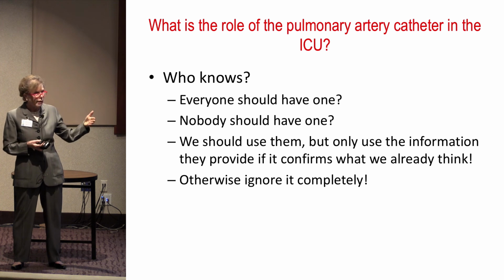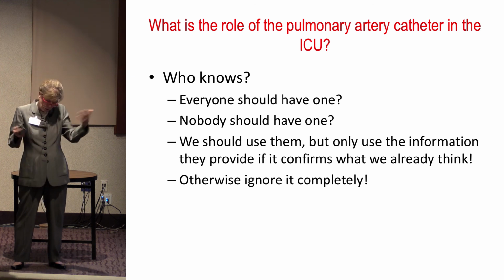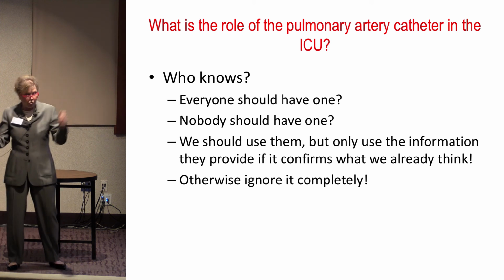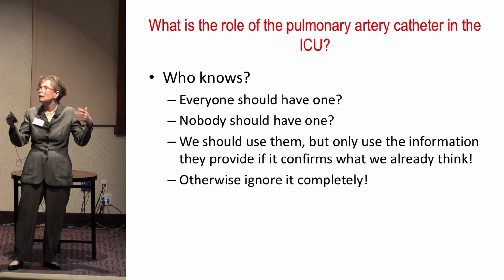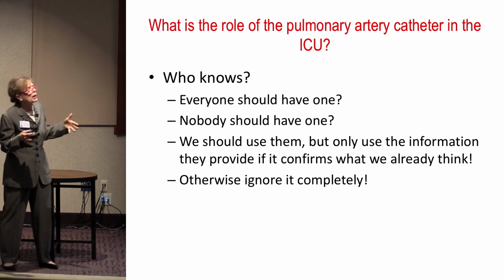The role of the PA catheter is more about looking at right heart evaluation. So, those are the questions. When I started in practice, which was before half of you were even born, everybody, their brother, their dog, their cat, their uncle, it didn't matter who they were, they all got a PA catheter. So that was in the time when everyone needs it. And today we say nobody needs it. Well, there's something in between.